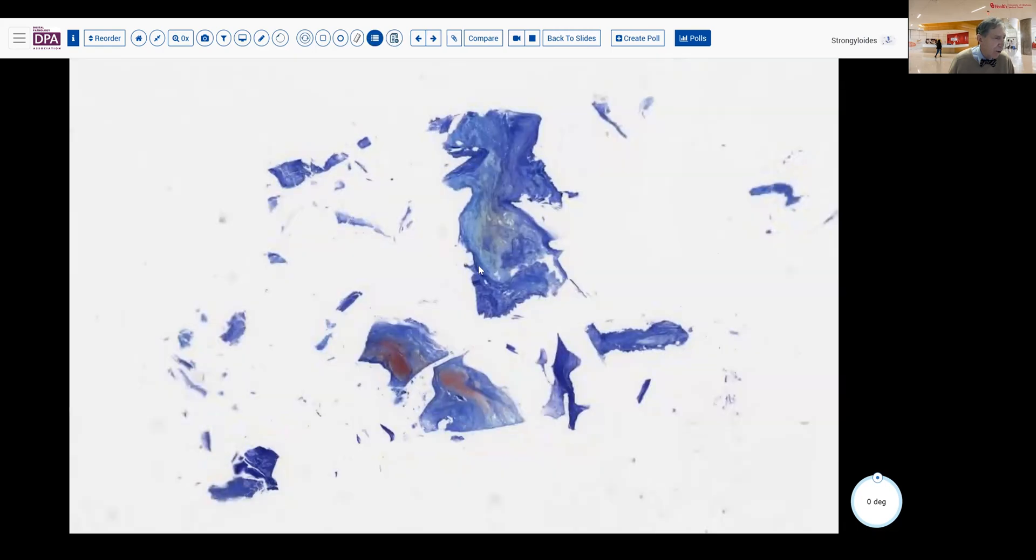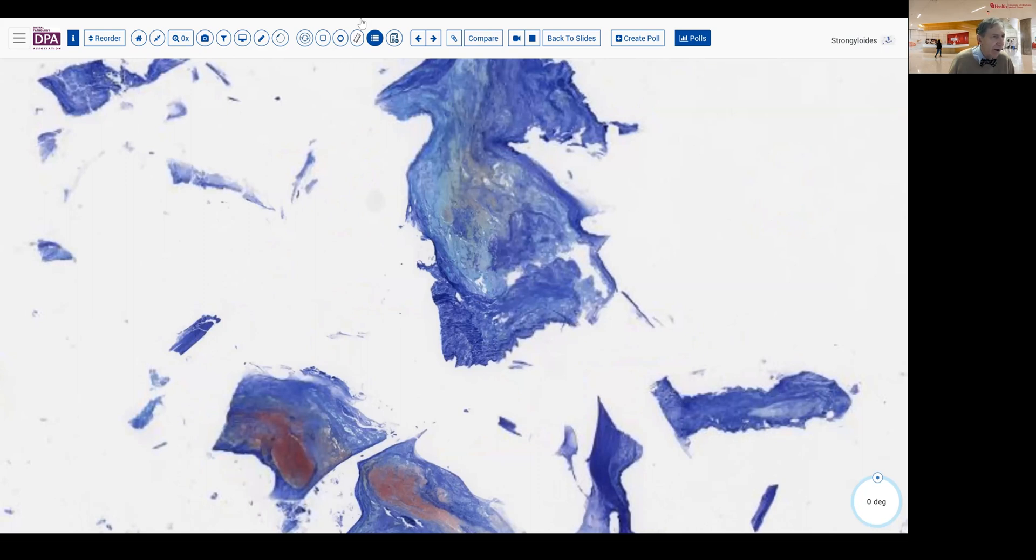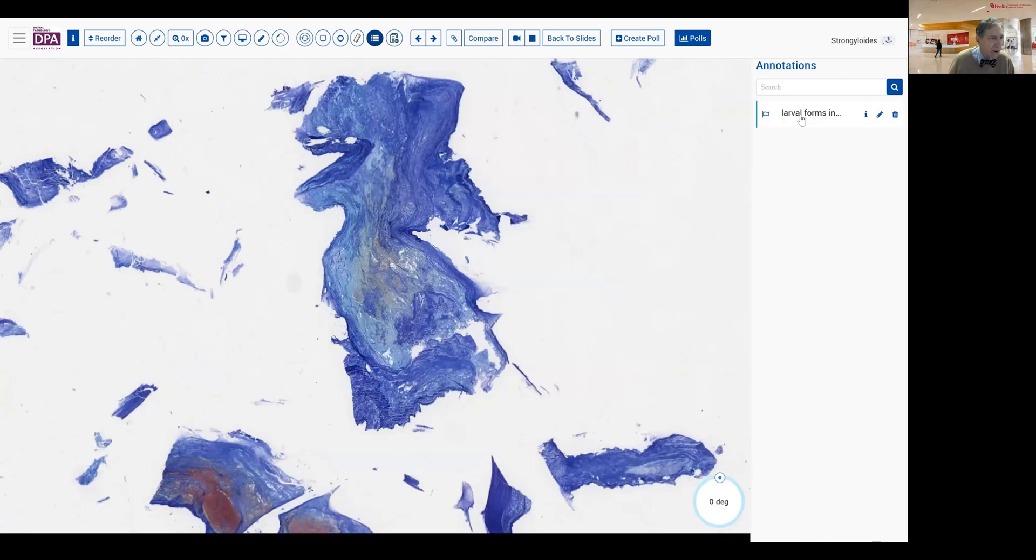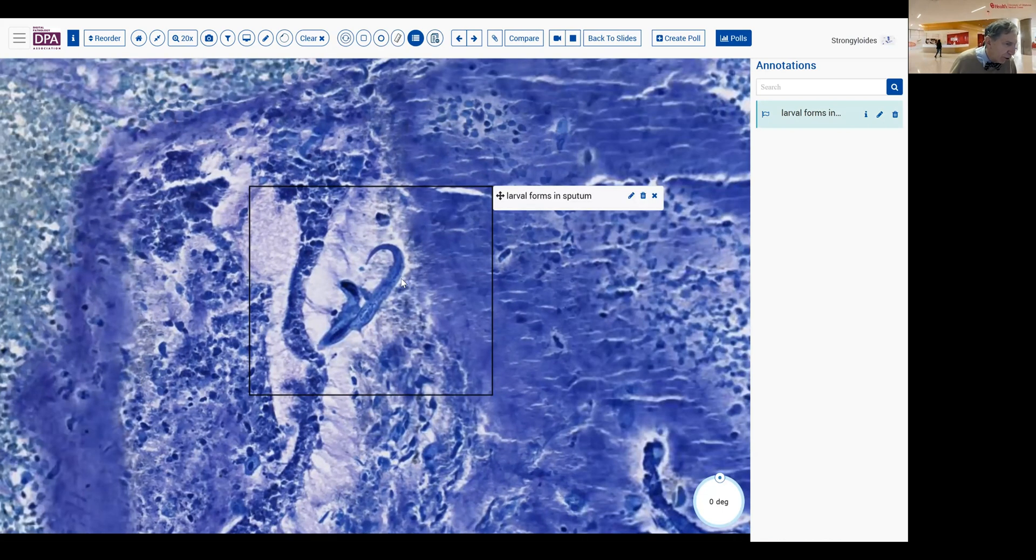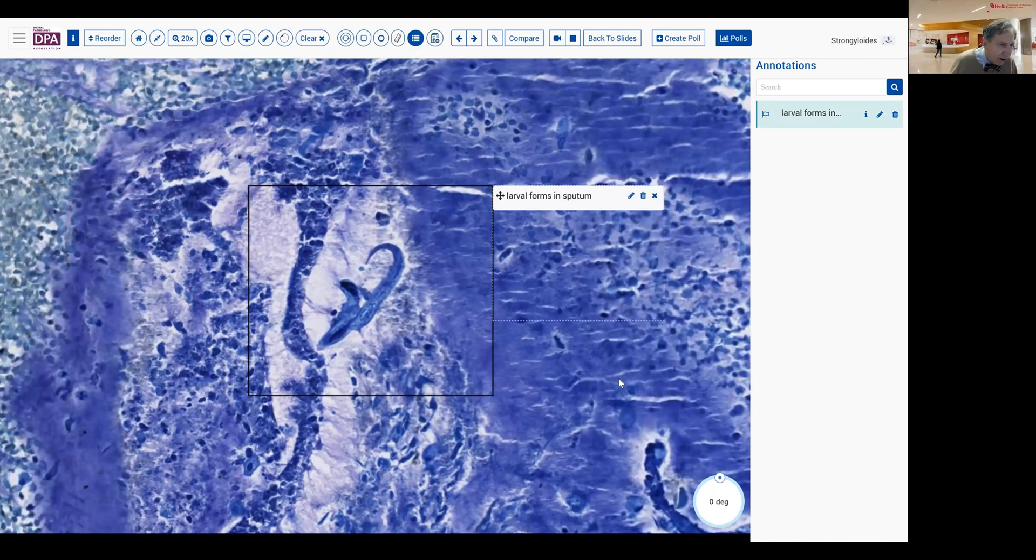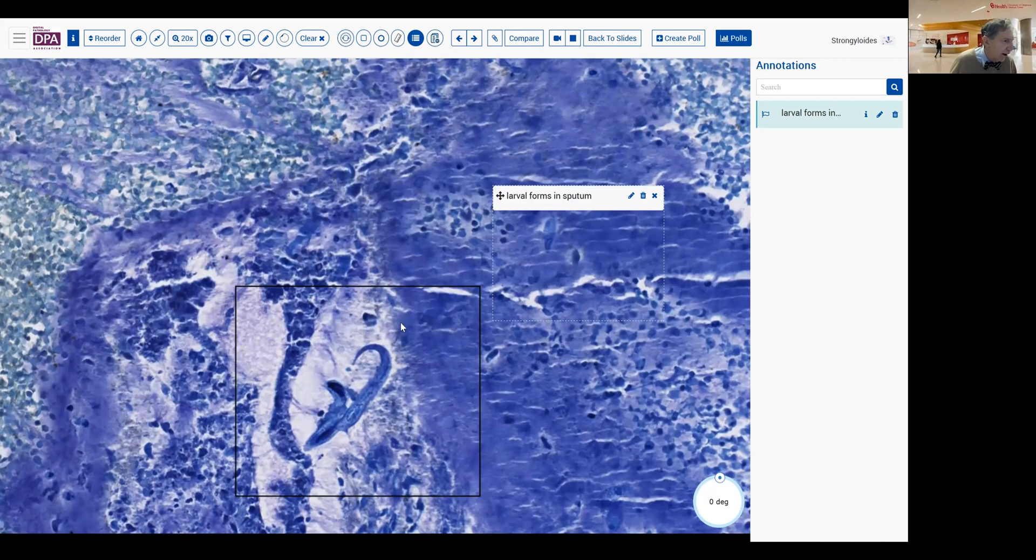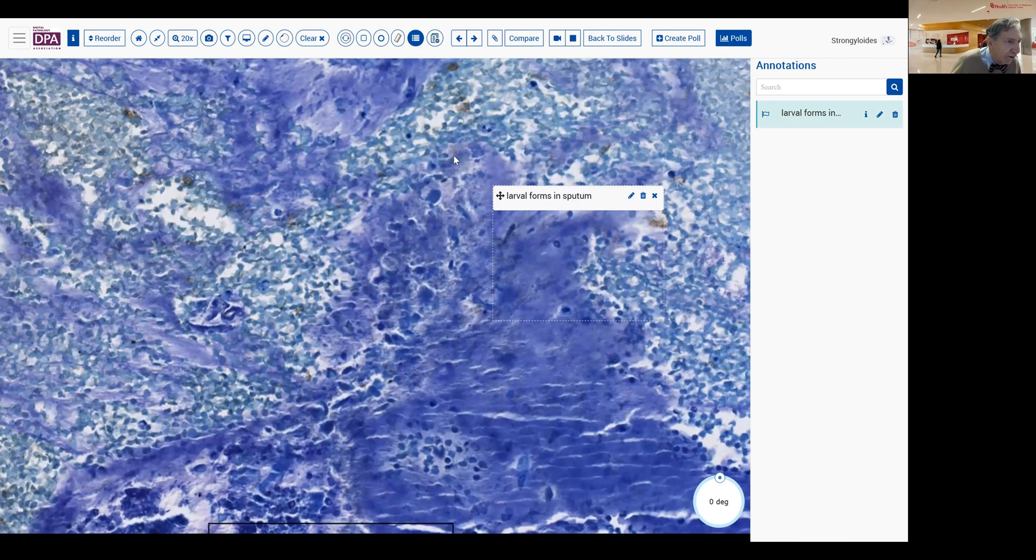Now, let's just take a look at what it looks like in sputum. Here's a sputum sample stained with the Giemsa technique, and we'll go right to the organisms here. As you can see, the full organism has a pointed tail, and various internal structures can be identified. And you might also be able to identify other forms in here as well.